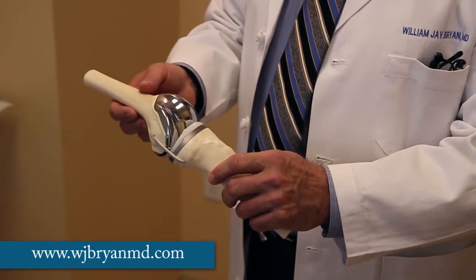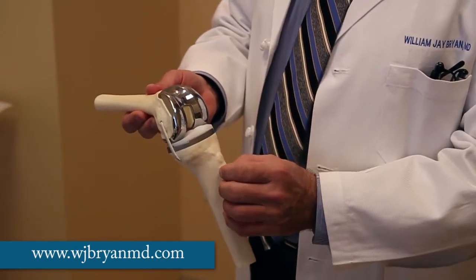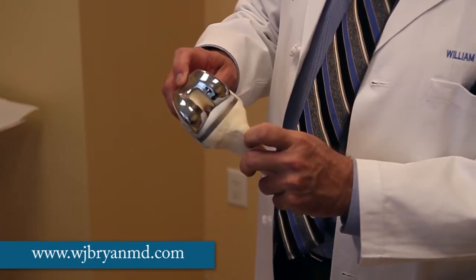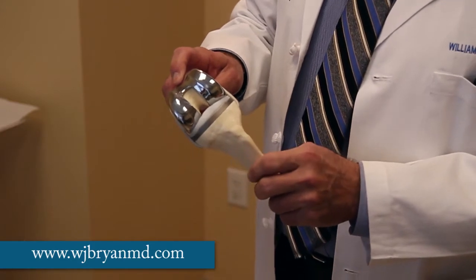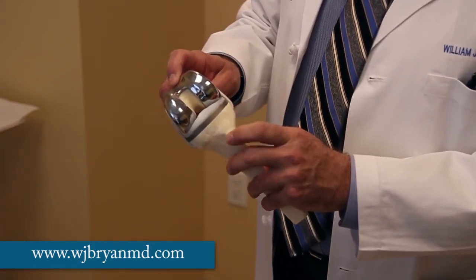First we put in trials, and from those trials we pick the shape and size that's best for you. On the tibial side, the bone is very precisely cut, and a metal tray, which is generally made of titanium, is either cemented or held to the tibia with a roughened surface.